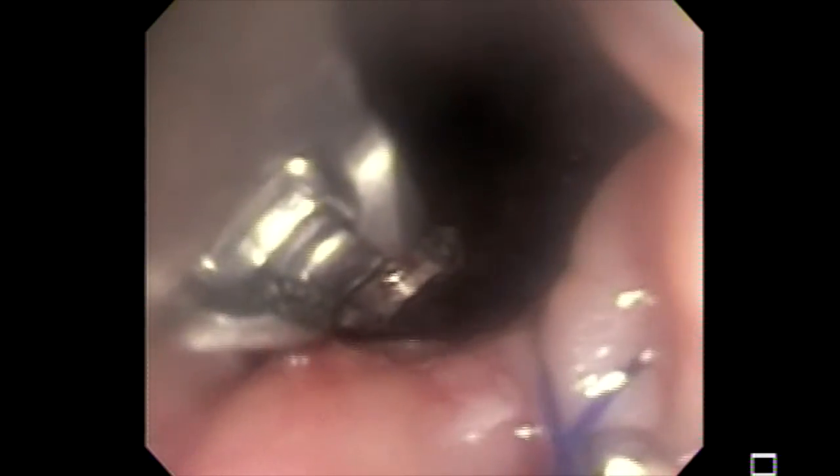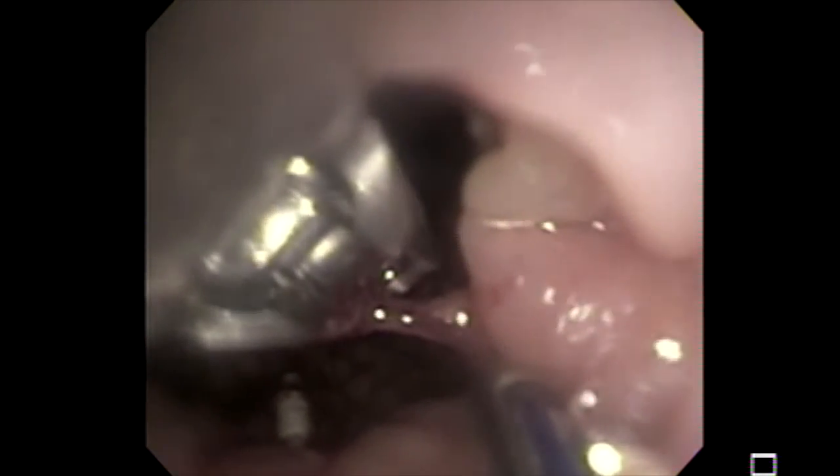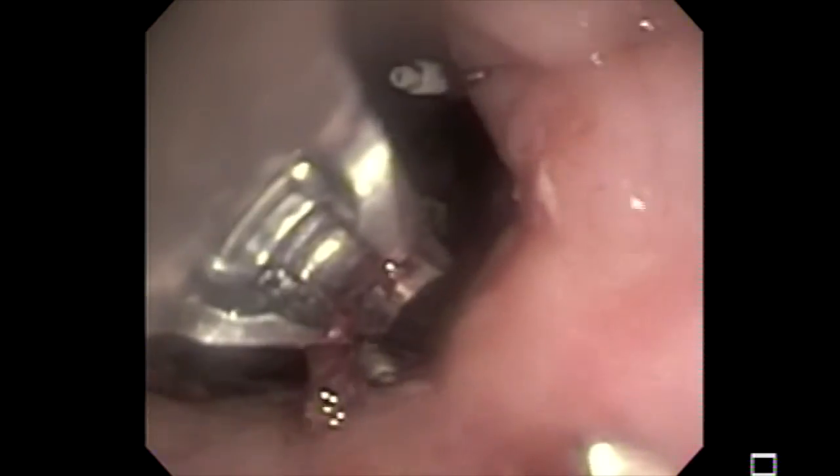Once we do that, we'll cinch our suture to ensure that the stent is in place. Although we'd like to have it tight, we don't want it to be very tight, because if it is very tight, you may have a problem later on with the mucosa being cut. So we want it tight, but to some extent. Thank you.